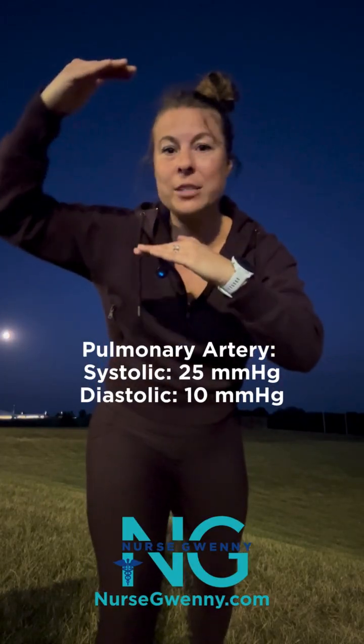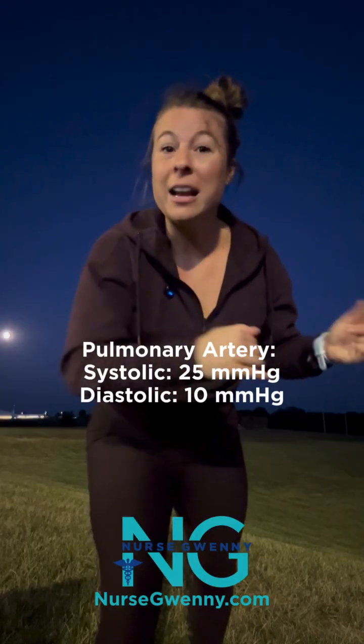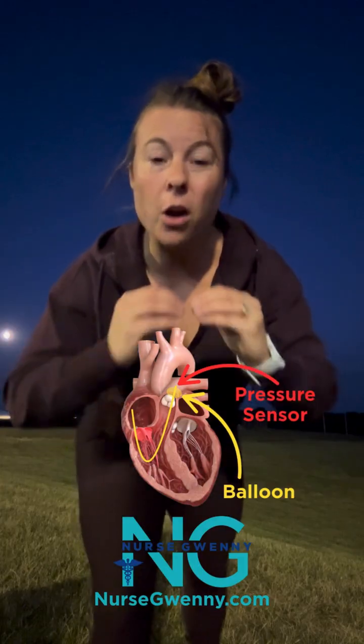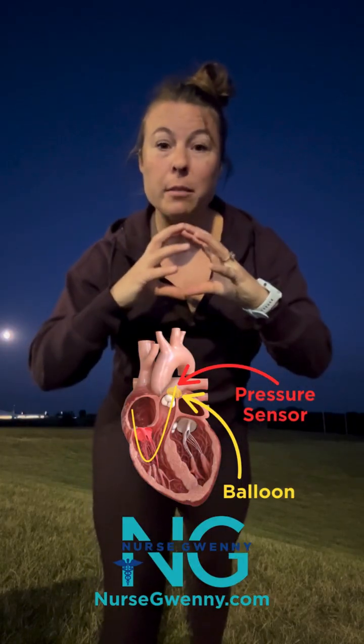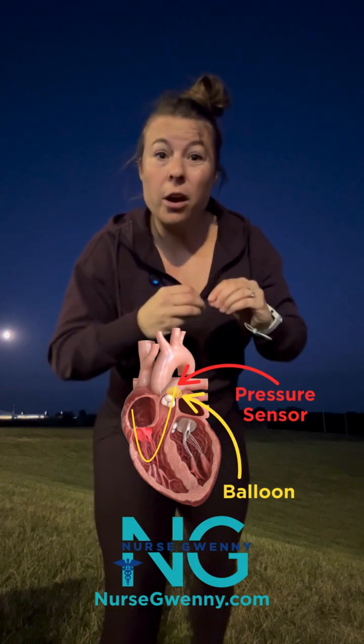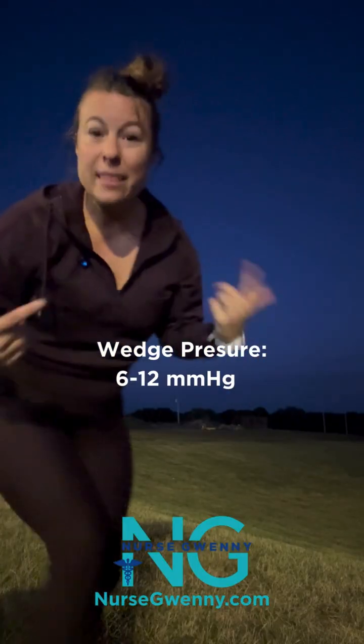So 25 over 10, quarter over dime, is our normal pulmonary artery pressure. And then our normal wedge pressure, which is also taken in the pulmonary artery, but that's when we inflate the balloon that's at the very edge tip of that pulmonary artery catheter. That allows us to measure the pressure that's hanging out in the pulmonary vasculature.